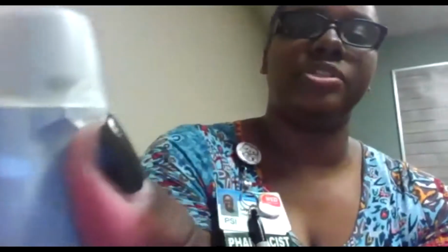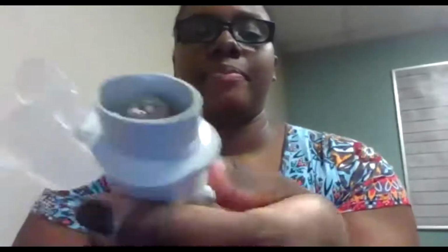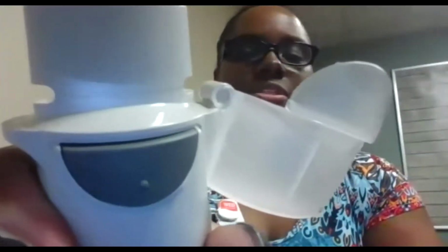Once you load your dose, you're going to open the cap. There's a little lip here that you can push with your finger. And then this is what the mouthpiece looks like. You're going to form a tight seal, like all the other inhalers. Clear all the air out of your lungs, and form a tight seal around the inhaler. It's very important that you do not cover these little vents here, similar to the Ellipta inhaler. You want to make sure that you can actually get your dose, so do not cover these vents. And then we have a button right here that actually releases your dose.